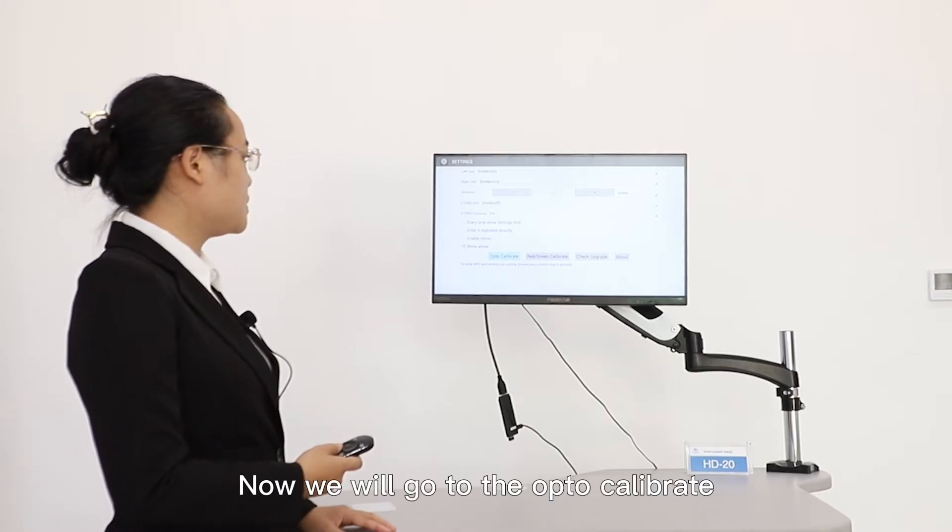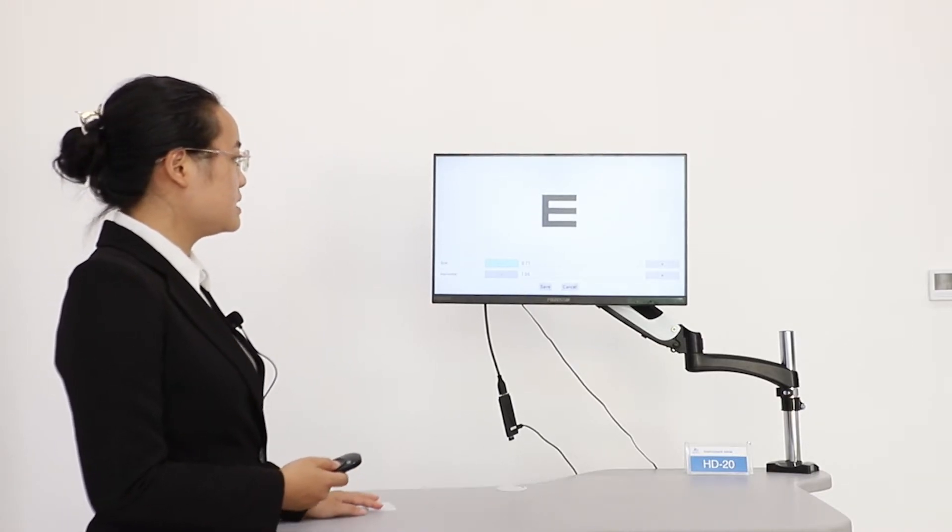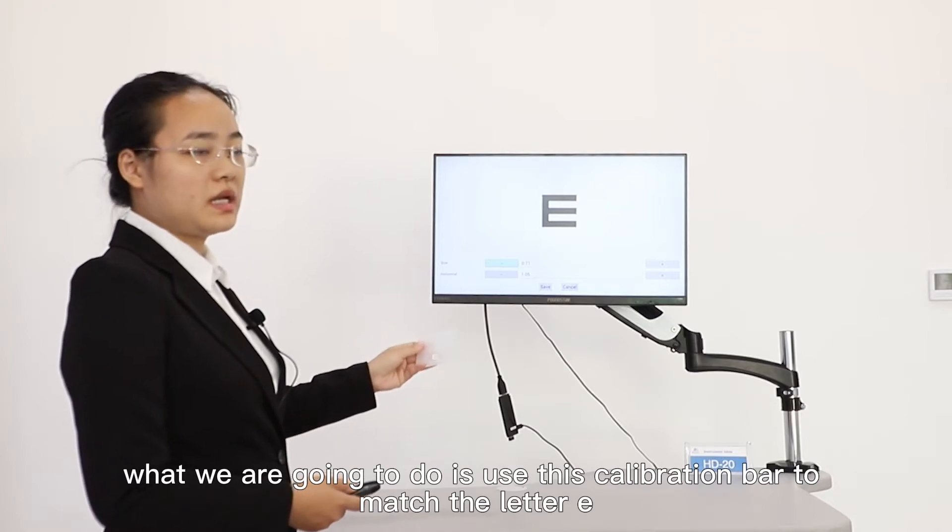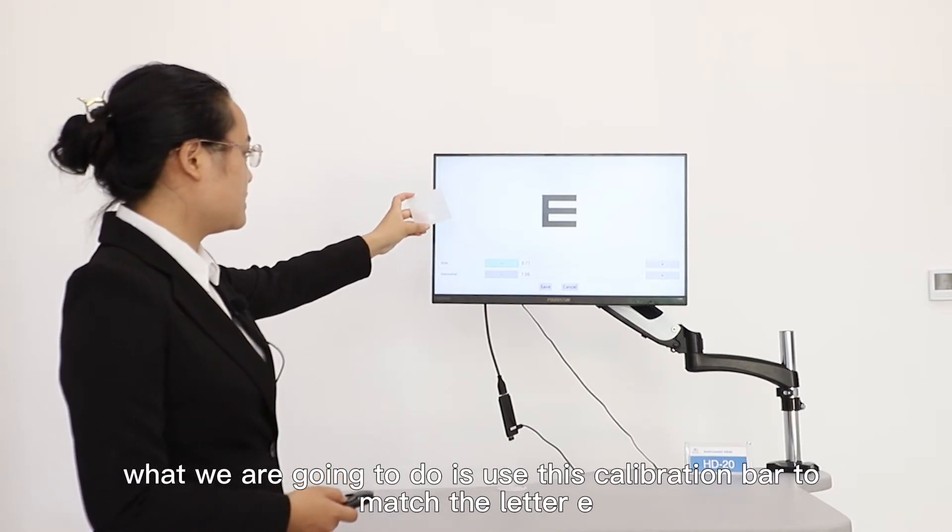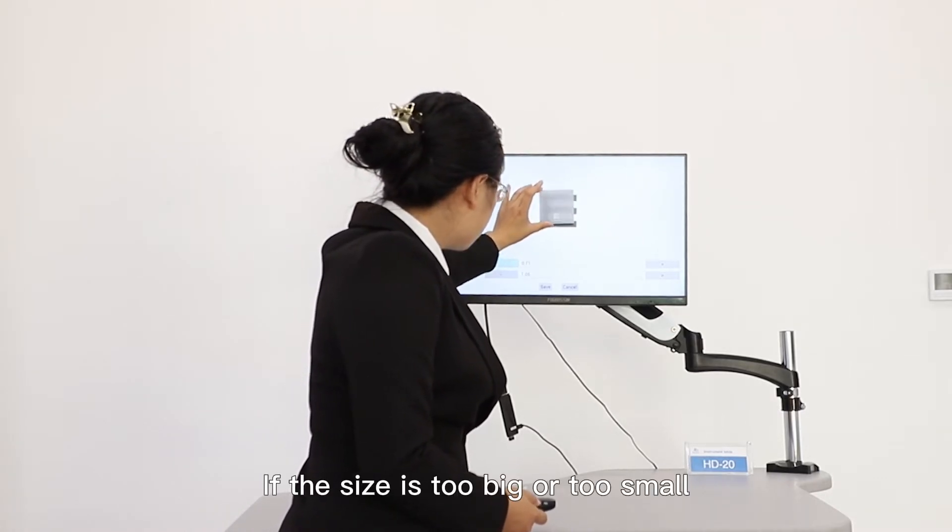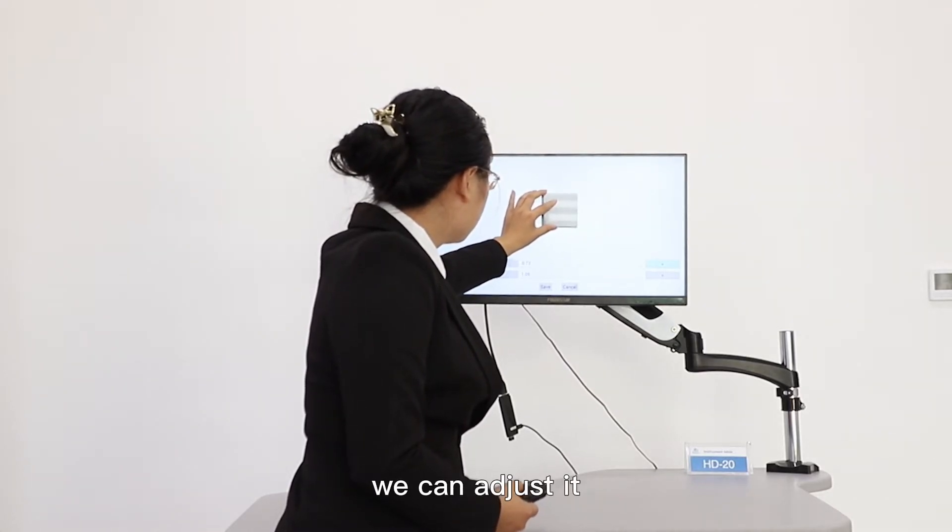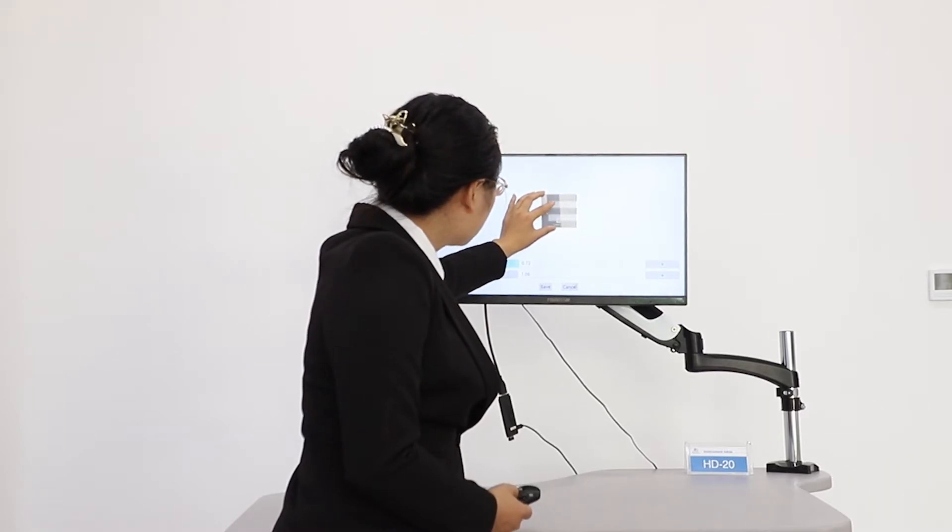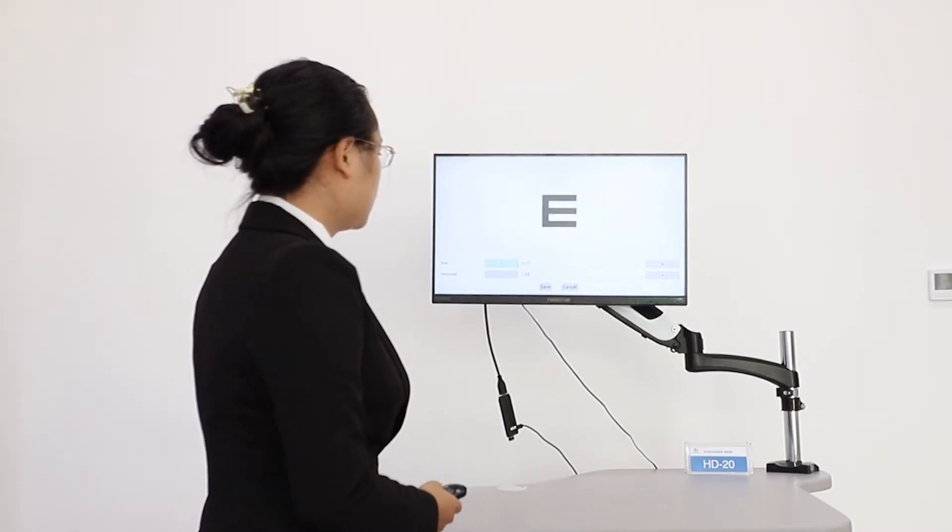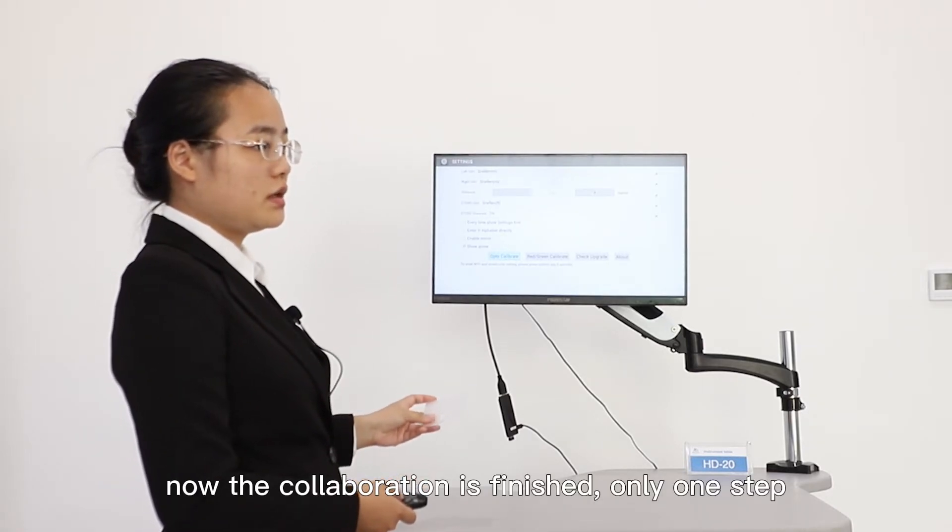Now we will go to the opto-calibrate. As you can see, there is a letter E on the monitor. All we need to do is use this calibration bar to match the letter E. If the size is too big or too small, we can adjust it until the calibration bar fits the letter E. Then we will click save. Now the calibration is finished. Only one step.